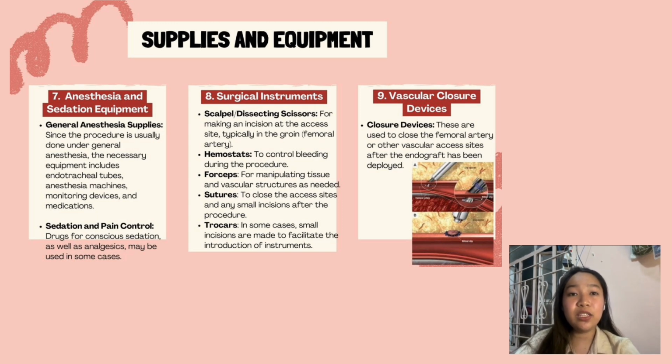Surgical instruments are specialized tools used by surgeons and medical professionals to perform surgical procedures. They are designed to aid in cutting, dissecting, grasping, holding, retracting, suturing, or modifying tissues.